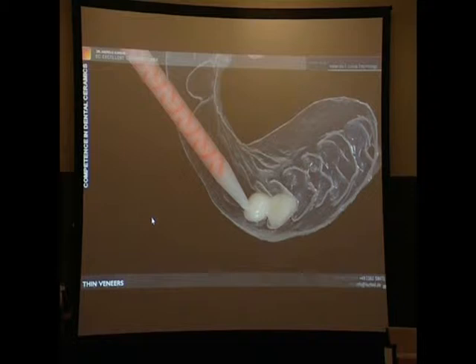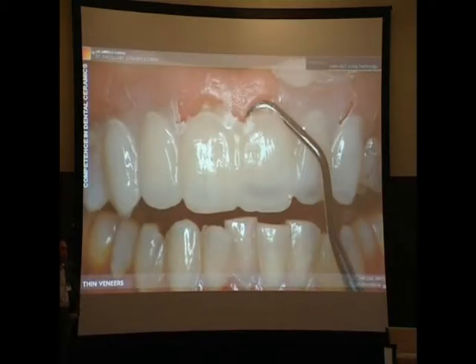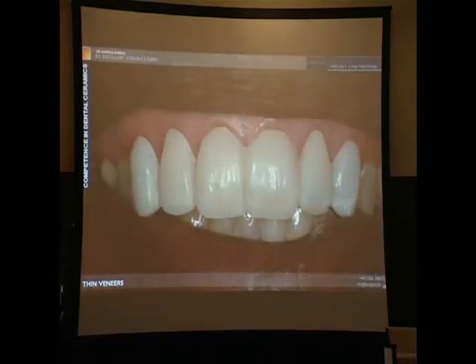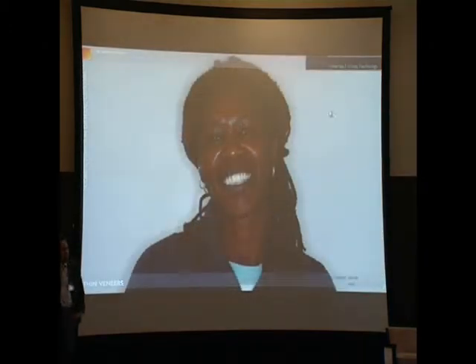Now I have this great idea with the silicone. If I would redo the case, I would use the silicone. Here you can see you have to remove the splint carefully and clear the margins. You don't have to do that when you use the silicone. And now we learn from this wax-up. Look at the left canine here. I made this a little bit shorter because our wax-up is standing out of the lower lip, and that's not good. So this is not the final restoration.